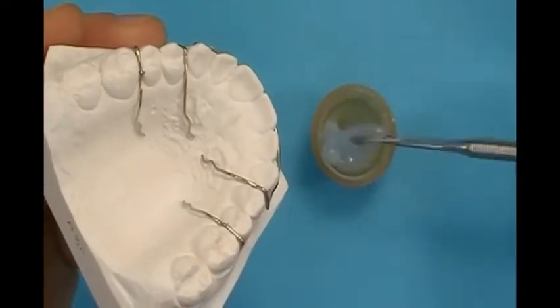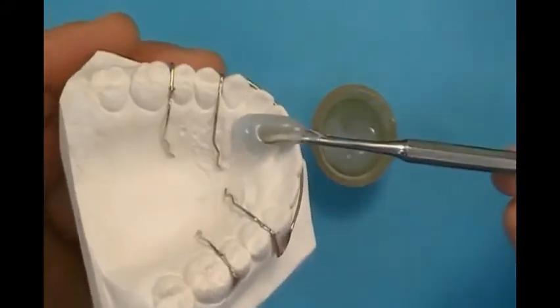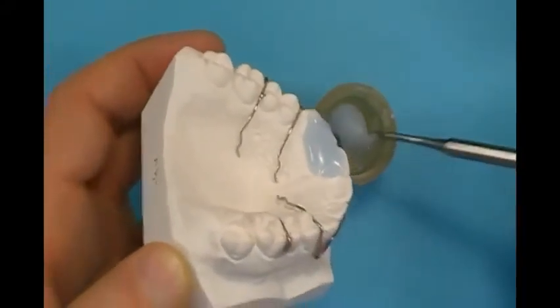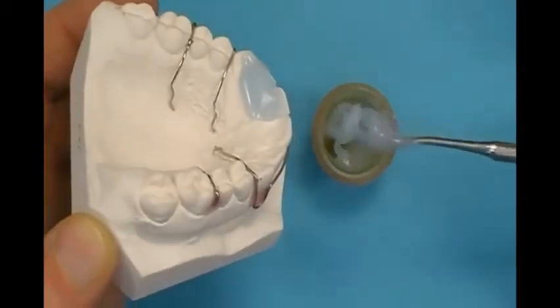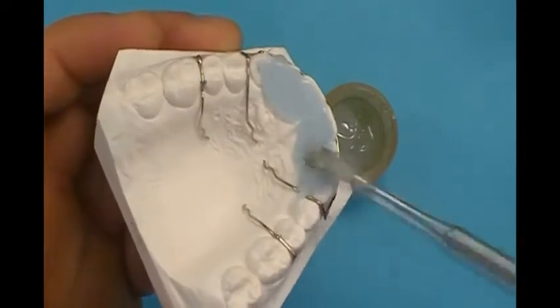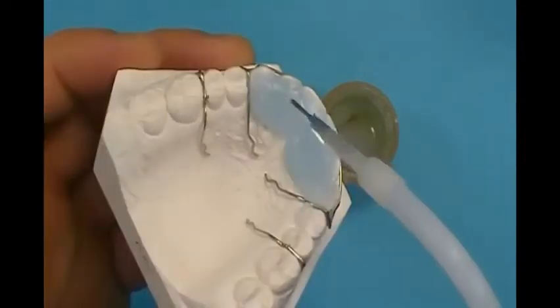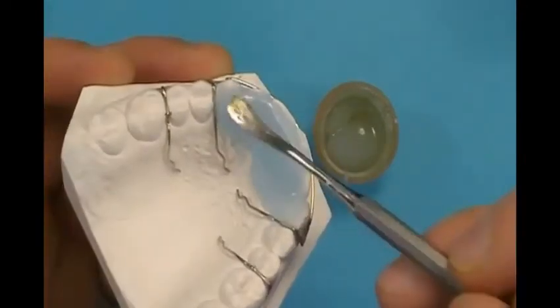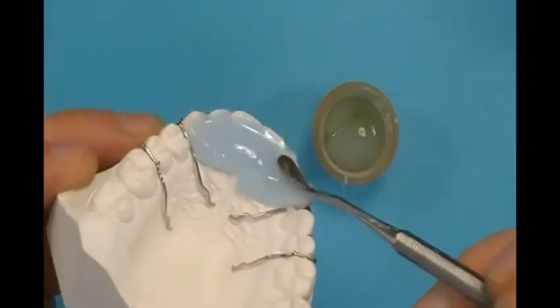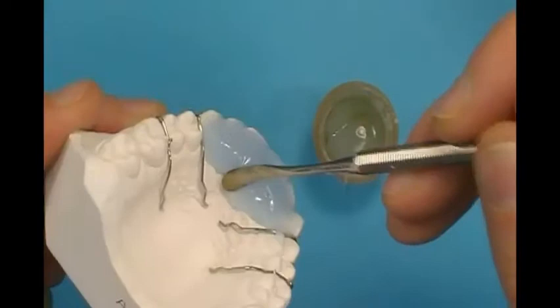Build an acrylic ledge lingual to the anterior teeth with resin. Adjust height to prescribed level. Make sure applied acrylic will occlude against opposing teeth.